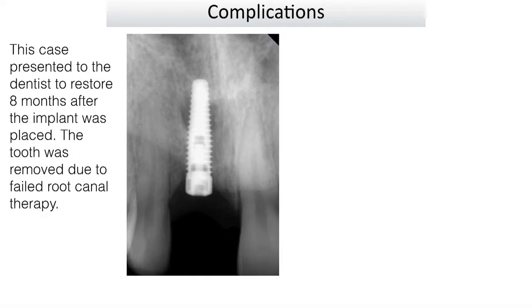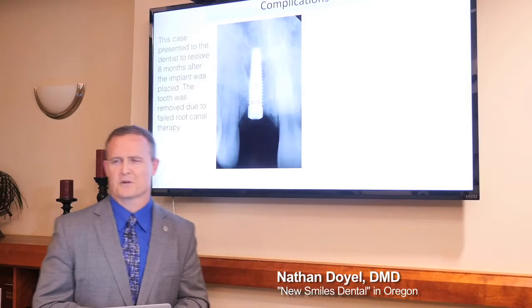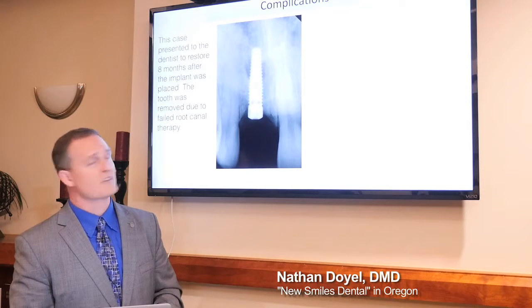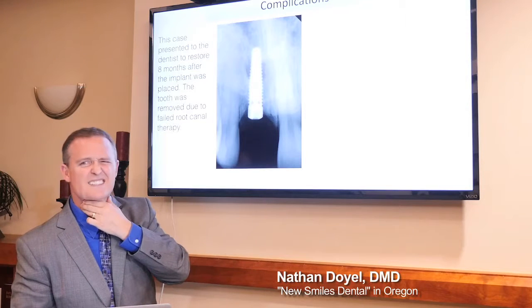This is an example right here of complications. This case presented to a dentist 8 months after the implant was in place, asking the doctor to restore it. And what would you do? What would you guys do? Any concerns you see that you might want to be concerned about? Yeah, so right here in the middle, you have this lucency. What do you think it is?